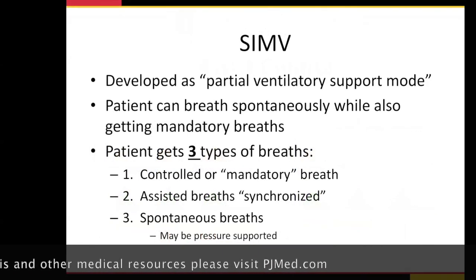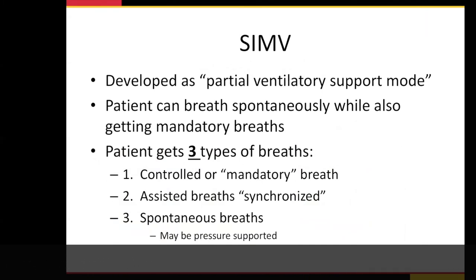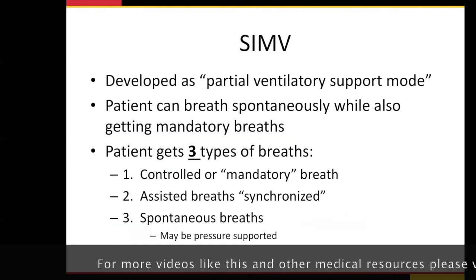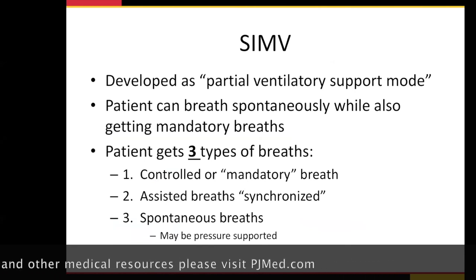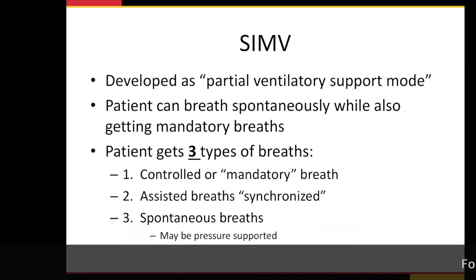Next, SIMV. You may or may not be using this, but it's another confusing term. It was really developed as a partial ventilatory mode. We use this a lot in surgical patients because the way this works is, think of it as just like assist control, like I just showed you, only the difference is maybe the patient does want to take a breath in between every now and then. Well, guess what? We can let them do that and we can help them. We can give them some support. We can give them some pressure support in between.